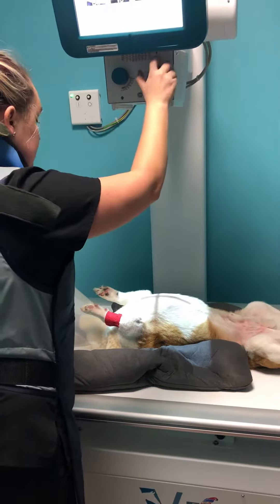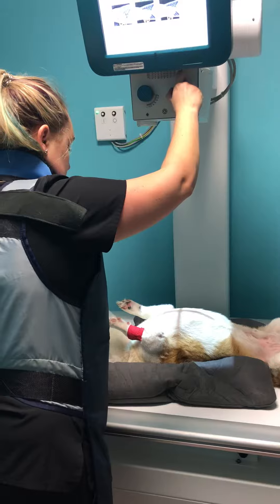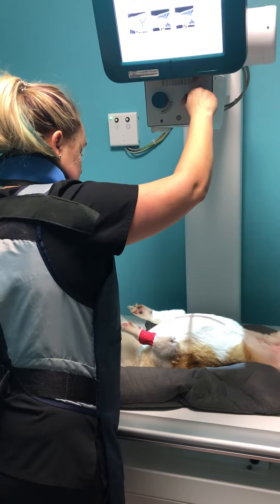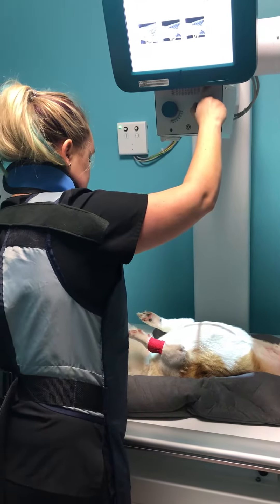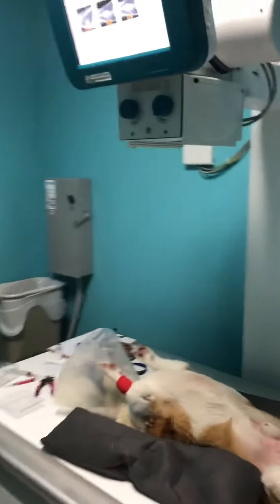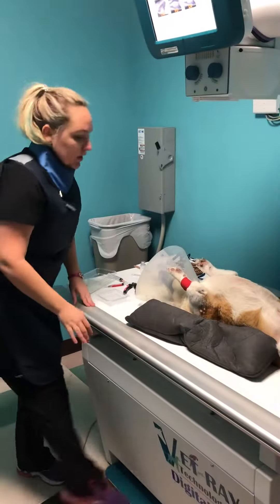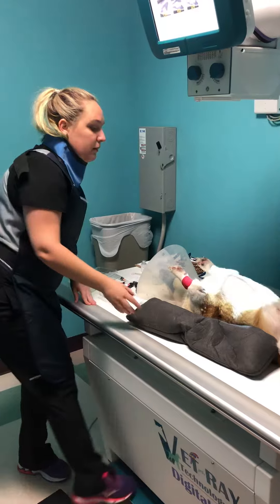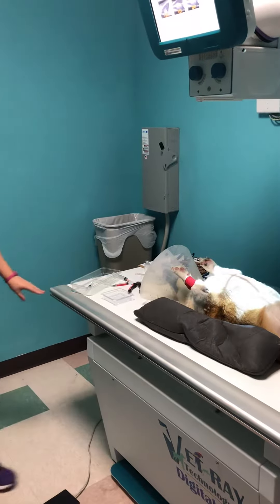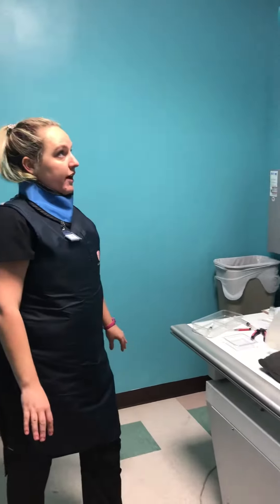We will collimate to make sure that we have the smallest field that we possibly can. Then we will take our pedal now that we are in position, and we will snap our radiograph.